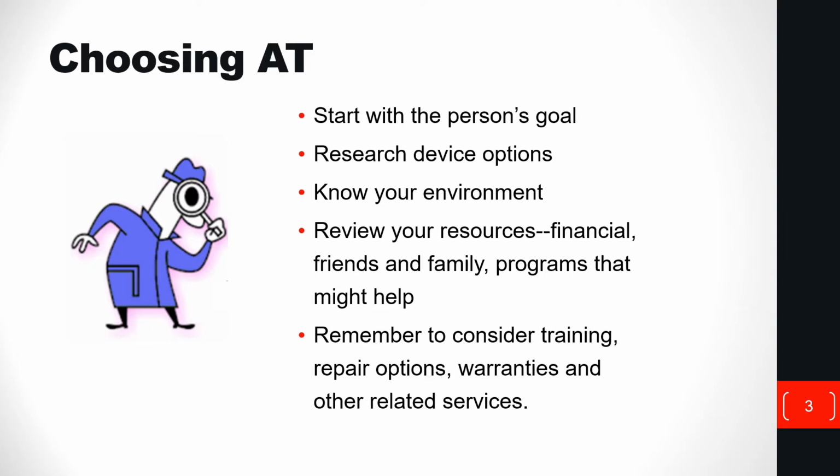Let's take a look at a few items. Hi everyone, it's Mike from Disability Network coming at you with another assistive technology demo. What we're going to talk about today is something called a hip kit. It has 5 items in it. It helps you with bathing, dressing, putting on shoes, and those kinds of things. So let's get started. The first thing I have for you is called a bathing stick.